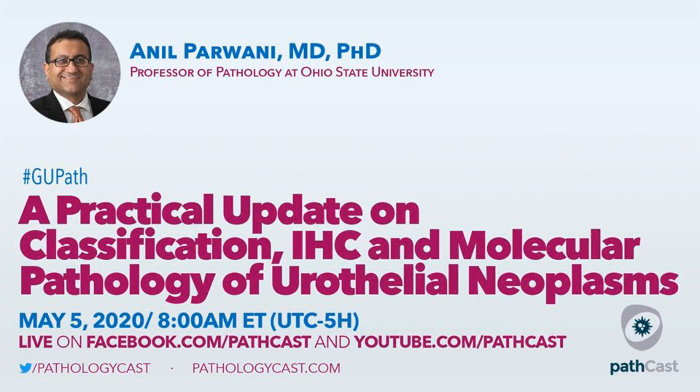But if I see a very unusual nested pattern, I don't see a lot of mitoses, I don't see a lot of atypia, I question myself. I stop, I pause, and I wonder, could this be a paraganglioma? That eosinophilic material is not always seen. It's seen, I would say, in 50% of the cases.